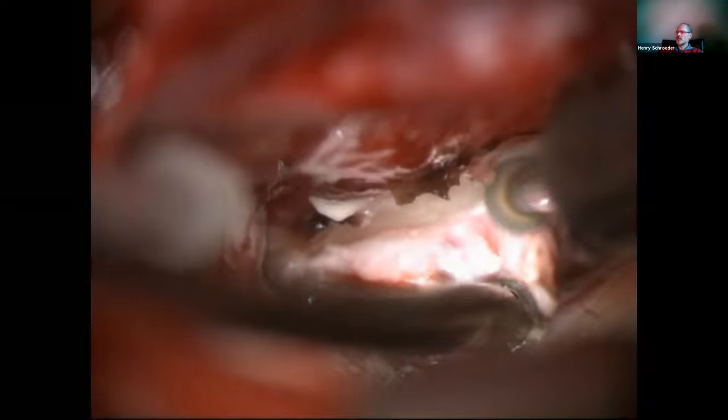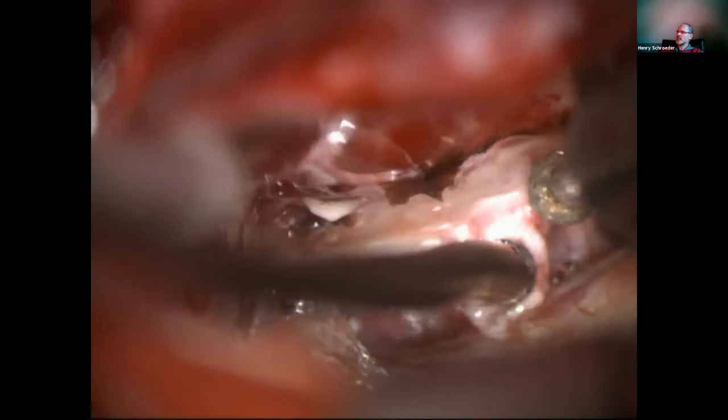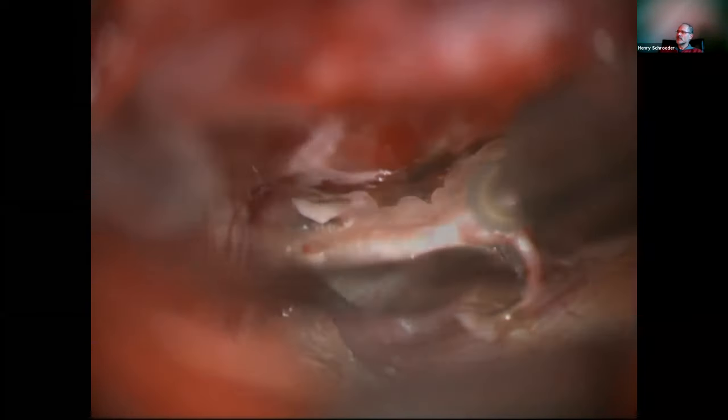And then at first we have to open the dura, and then we have to drill a little bit of the anterior clinoid process to get access to the base of the aneurysm. The aneurysm is protected by the dura, which was elevated. And then we dissect, cut the dura here, and then we get access to the carotid in front of the aneurysm. We excise the dura.